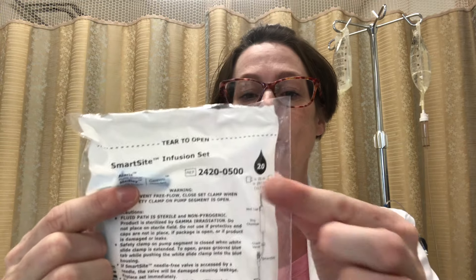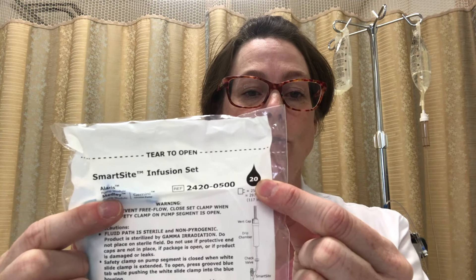The next thing you need is your primary line. I'm using an Alaris pump here, so I need the SmartSight infusion set. If you're going to be calculating your drip rate by gravity, you'll need to note that it's 20 drops per ml for this set.